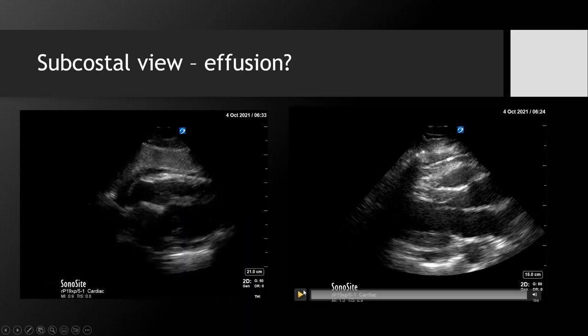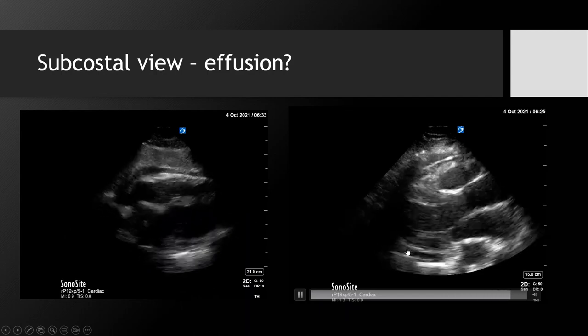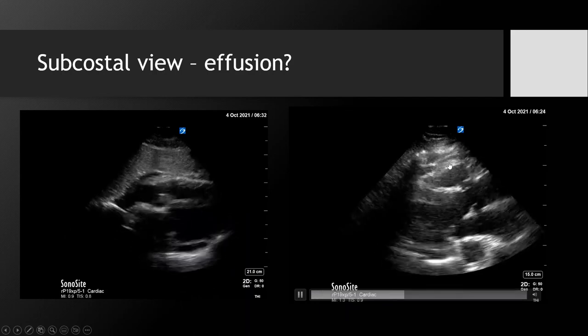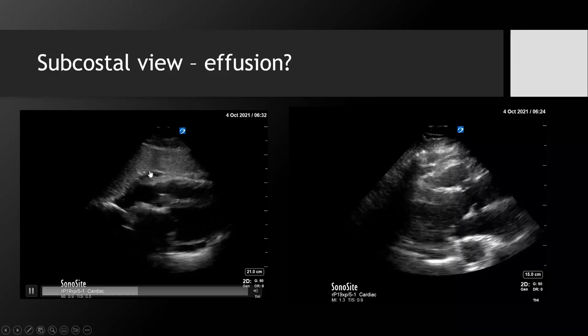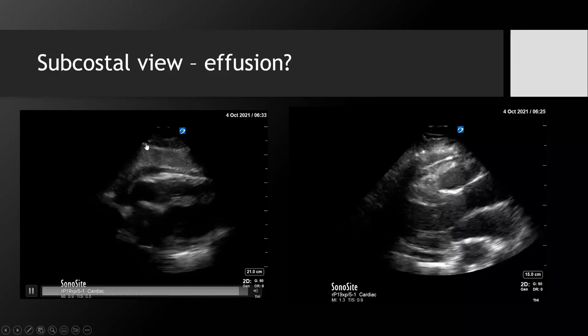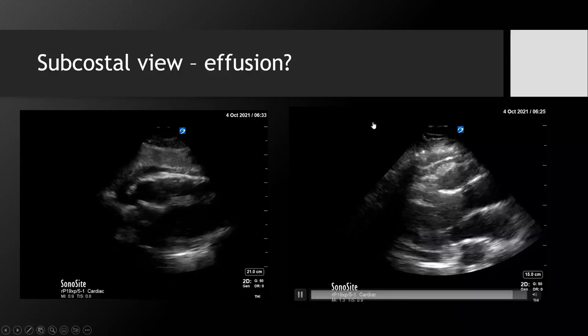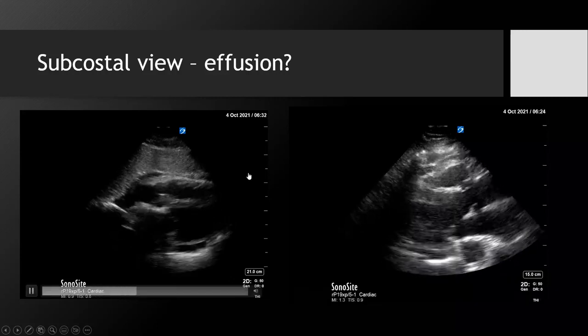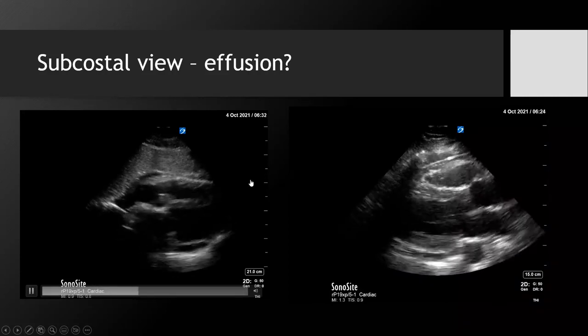But when I was in the parasternal long axis view, there is what seems to be a circumferential effusion. If there's an effusion on this side, then there's probably effusion here too. There could be some of both. Some of this could be epicardial fat and a trace effusion. Neither of these are dramatic. We're going to talk about tamponade another day, but I just thought this was a good opportunity to share this important piece of information: you can have an epicardial fat pad that looks like a pericardial effusion.